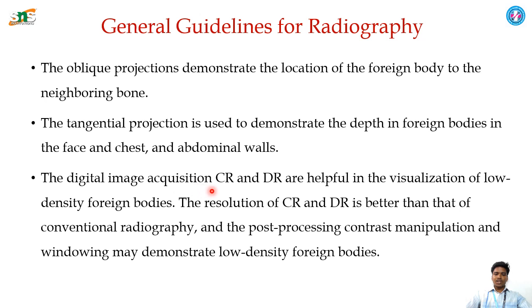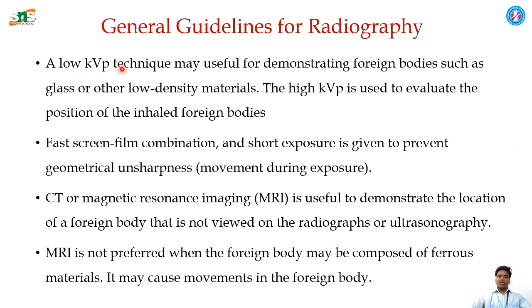The digital image acquisition, computed radiography and digital radiography, are helpful in the visualization of low density foreign bodies compared to conventional radiography. Post-processing contrast manipulations and windowing may demonstrate low density foreign bodies, and the patient dose is also reduced compared to conventional radiography. A low kVp technique is useful for demonstrating foreign bodies like glass and other low density materials, and a high kVp is used to evaluate the position of inhaled foreign bodies.